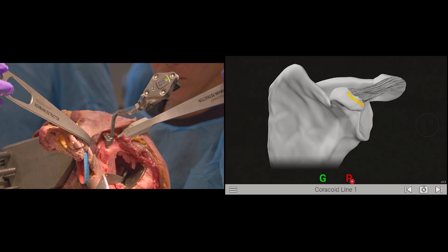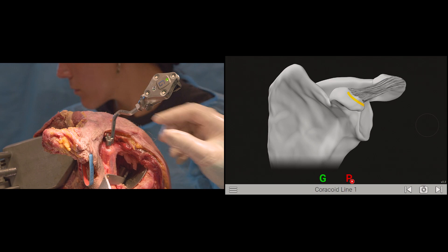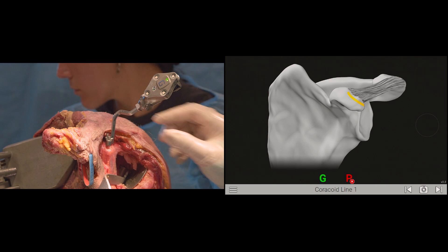At this point, I check the coracoid block to make sure it is well fixed. I do that by gently moving it anterior-posteriorly and making sure it's moving with the scapula. Once this is all confirmed, you can proceed with GPS acquisitions.